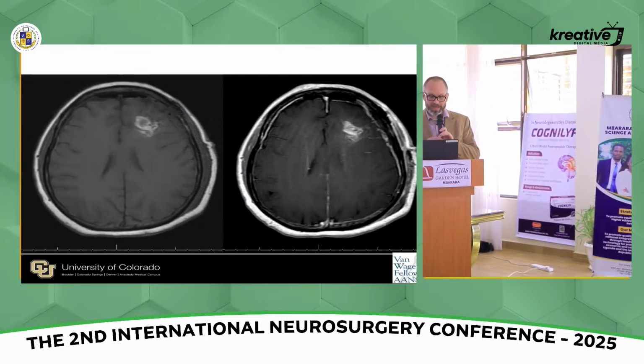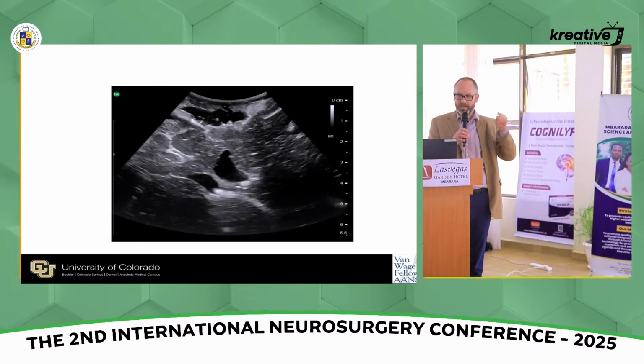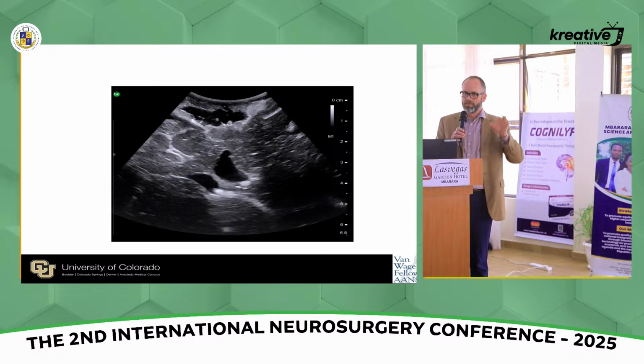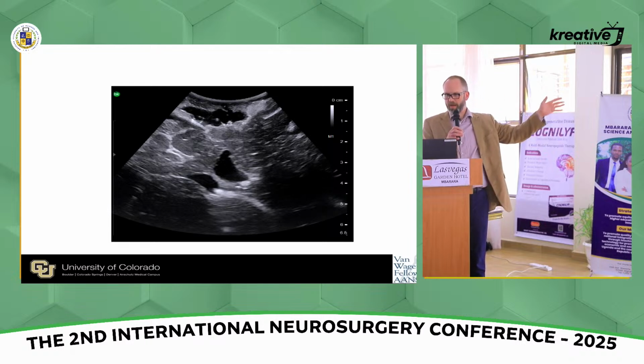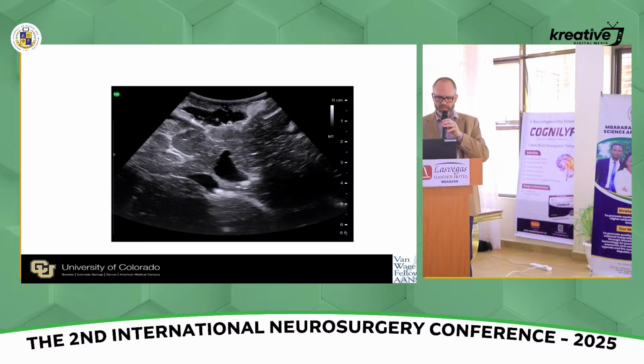Right, that can be bad in some settings, but also can be helpful. So if you take a very small piece, like a couple millimeter size piece of gel foam, that can be a marker to help you know where you are. So if you're under the microscope at the depth of the cavity, and the brain folds down on itself when you put the ultrasound in, and you don't know quite where you are anymore, putting a little marker with gel foam, now that's not big like this to block the whole signal, can just be a bright spot that you see to guide where you are on the screen.